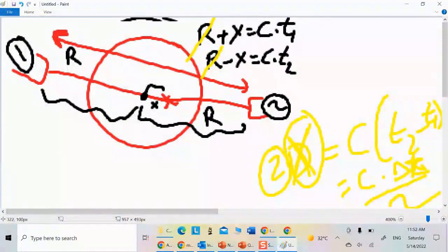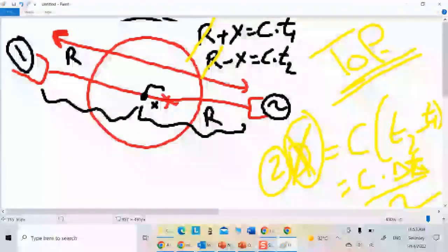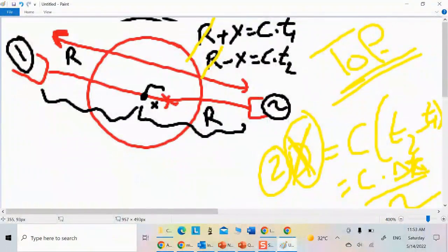So what is X? X is the distance from the center to the location of annihilation. At this moment, you are able to determine or confine the localization of annihilation more accurately. It is the time of flight that, through the time difference, can precisely determine the X in the localization area. Instead of taking a larger range for the localization, it is now more focused, allowing us to pinpoint the location of the annihilation more accurately. This is the time of flight technique.